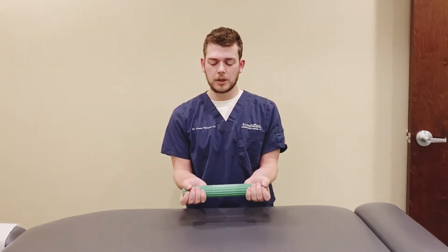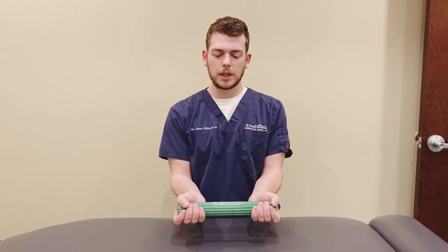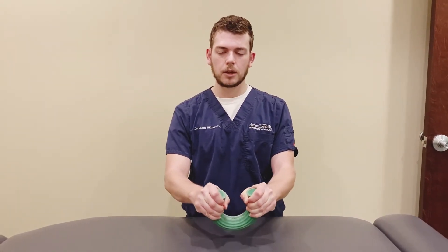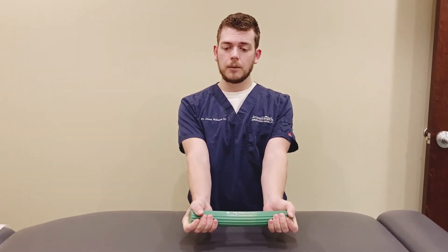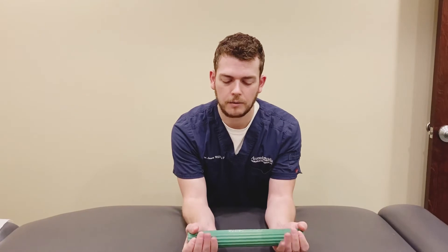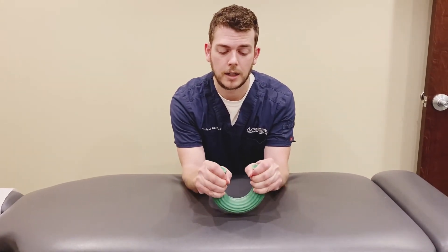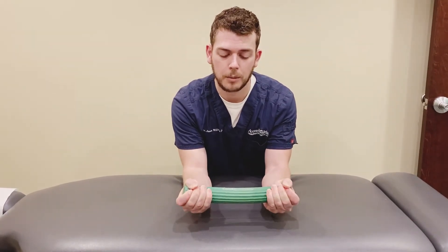For the bilateral pronation, we're just going to grab it with our palms up — so we're in supination — and then bring the ends towards each other. You can do this without your arms on the table, but you can see how it brings a little bit of your upper arm into the action. So I'd rather have you anchor your elbows down against the table and then bring the two ends together and apart.